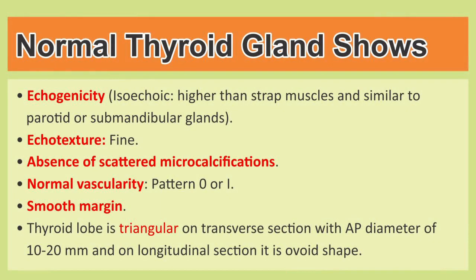Whenever we are doing the thyroid ultrasound we will consider the echogenicity, the ecotexture and also the calcifications, the vascularity and the margins. The normal thyroid gland echogenicity is isoechoic. It means that it is a little bit brighter or whitish as compared to the strap muscles, and it is the same in echogenicity to the parotid and submandibular glands.